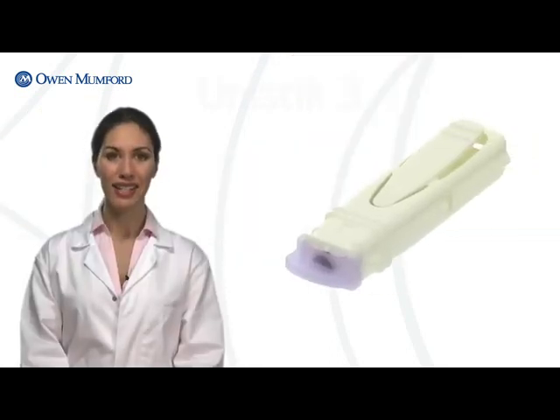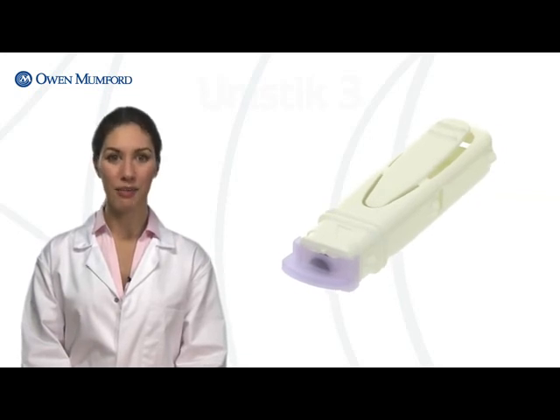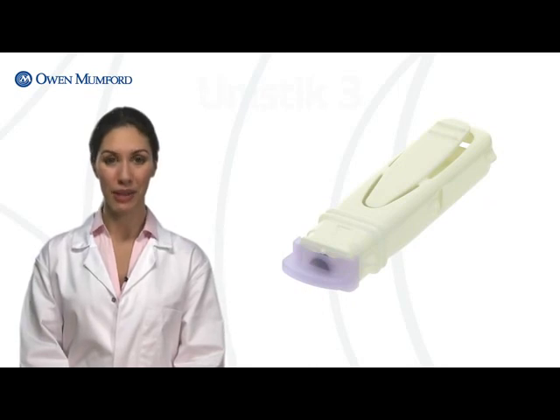As you've seen, Unistik3 safety lancets make capillary blood sampling quick, easy, safe and virtually pain-free for your patients.